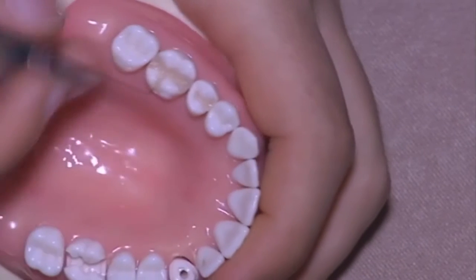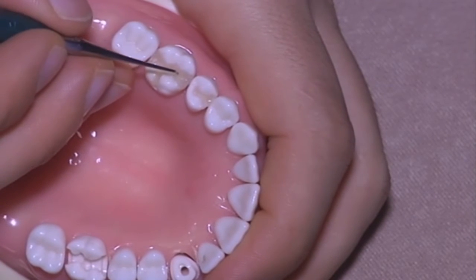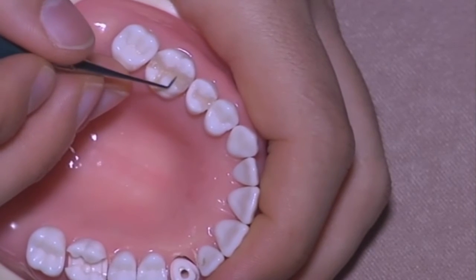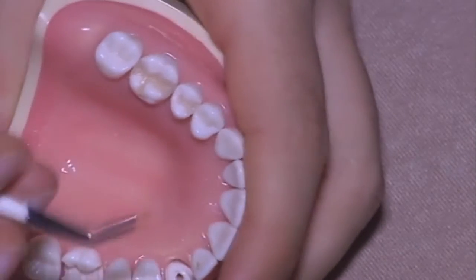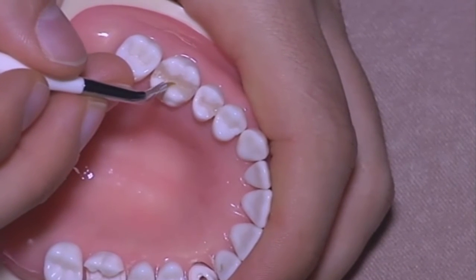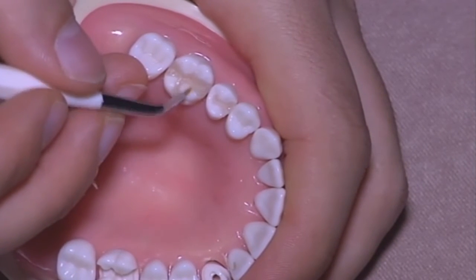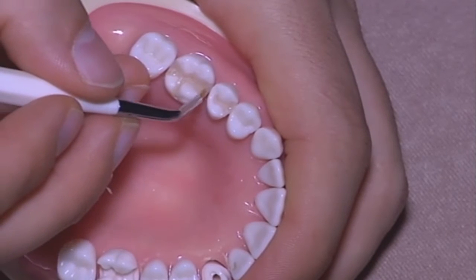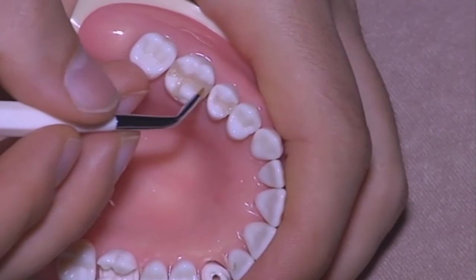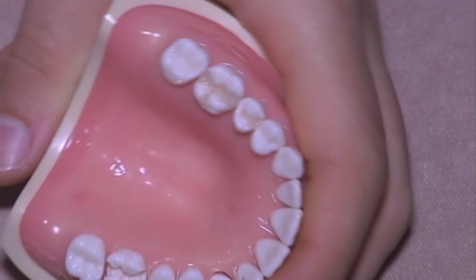in anterior teeth you have to avoid using the brush with the adhesive on it, because you get a yellowing effect because of the camphorquinone. The camphorquinone is yellow, and if you use the brush for the composite adaptation, you increase the amount of camphorquinone on the surface of the composite, and the consequence is a yellowing effect that will result in not a perfect color adaptation of your restorations.